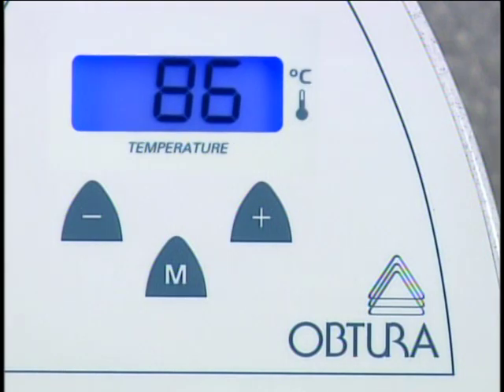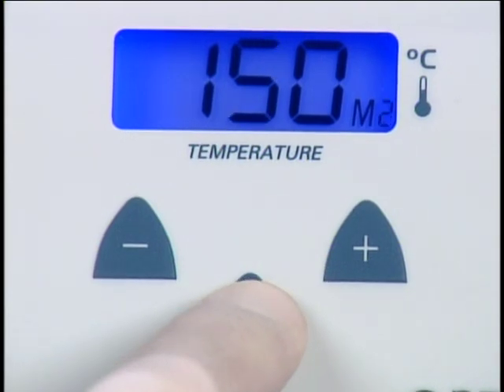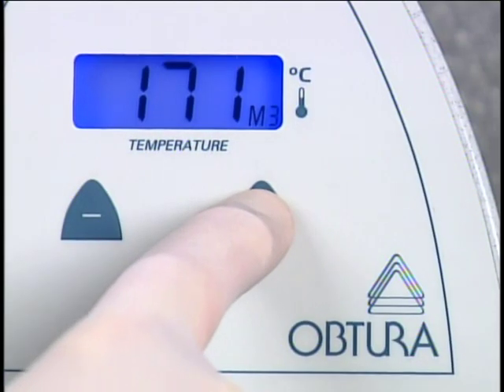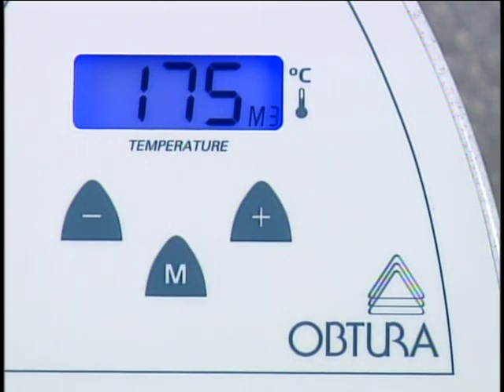To create your own preset temperature, first choose your desired memory preset, for example M1 or M2. Then, within five seconds, use the temperature up or down buttons to set the desired temperature.